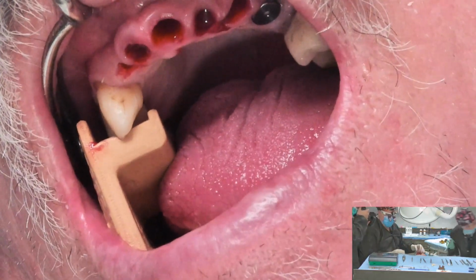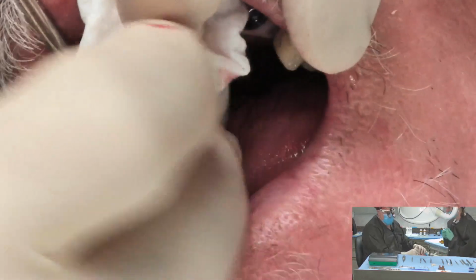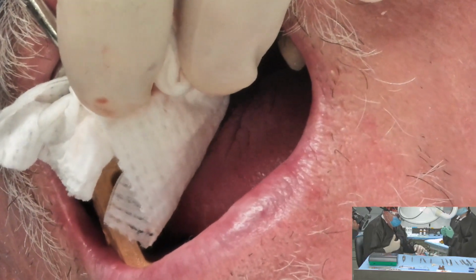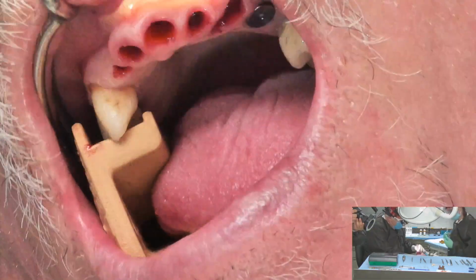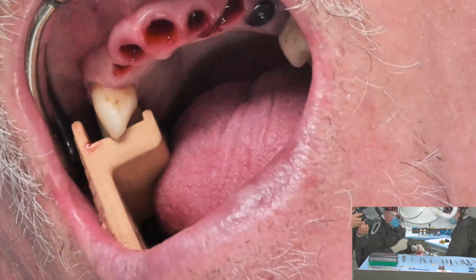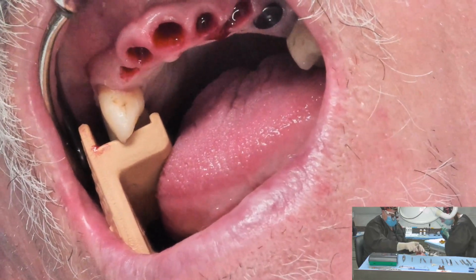Now, there's 2 ways to do site preparation. I'm going to do it because I've taken the time for myself to create my guide, ovate the models, set the case up aesthetically. So in my mind, I already know kind of what his emergence profile is going to be. So I'm going to initially mark the sites in the palatal shelf of where we're going to be placing the implants. And I'm going to go back and confirm that after I do my initial pass with the surgical guide.